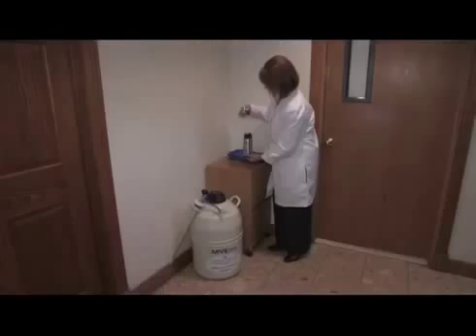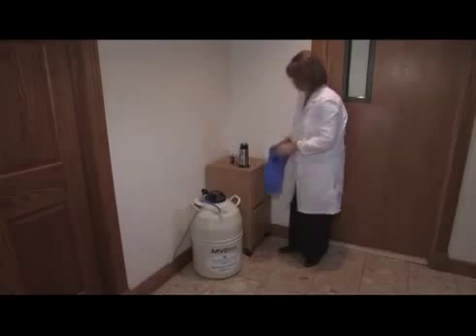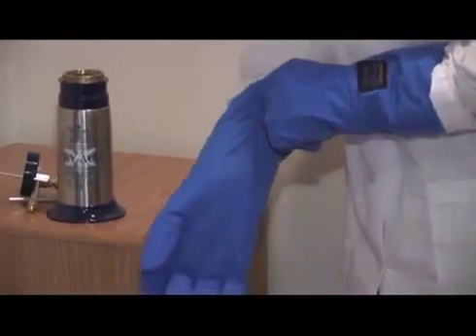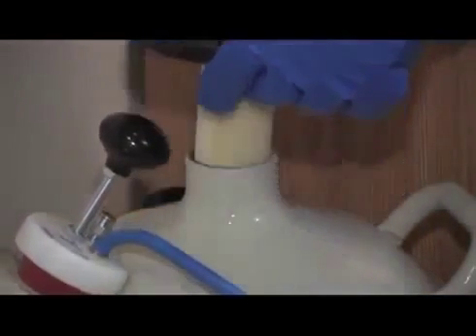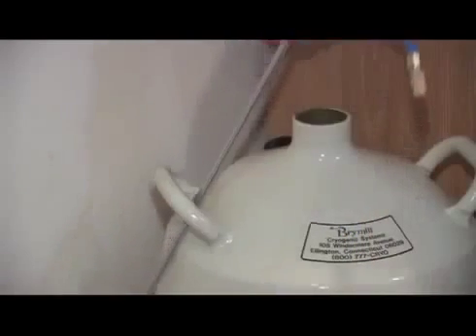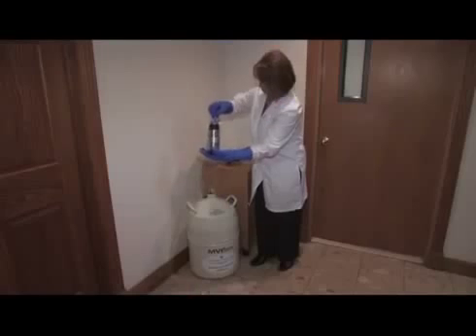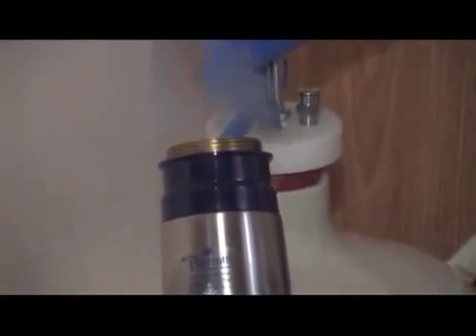Now let's fill your Cryac unit. Open the Cryac unit by unscrewing the top. Place the bottle on the table. Be sure to wear the appropriate recommended personal protective equipment. Remove the dewar cap and place it on the table. Pick up the bottle and withdrawal tube. Place the top of the withdrawal tube into the bottle. Lower the withdrawal tube with the bottle into the dewar, creating a seal.